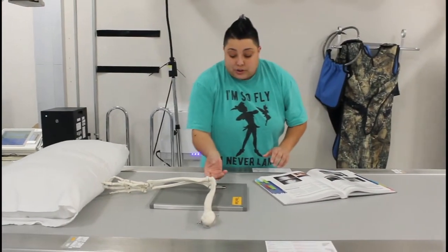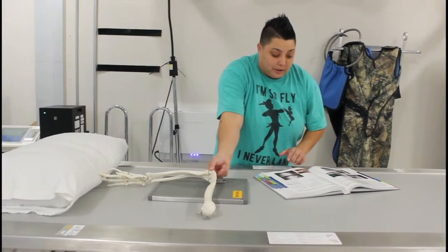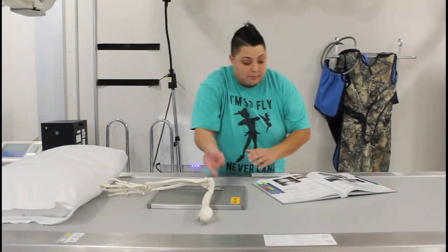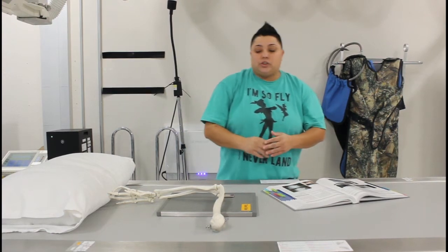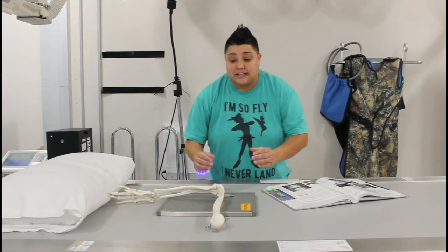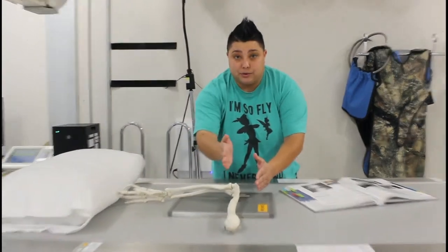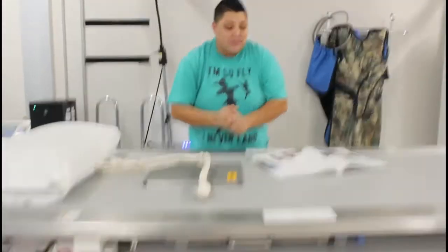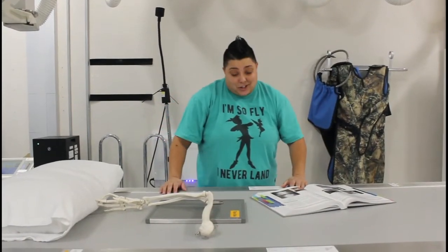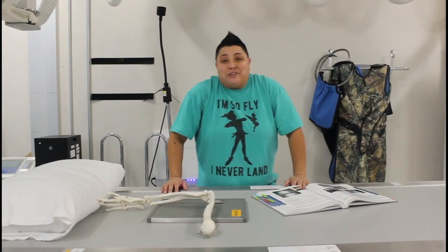You also want to make sure that you see the humeral epicondyles. They're going to be a little distorted because of the CR angulation. You also want to ensure that the elbow is flexed at a 90-degree angle. And the final thing you want to be sure of is that you have that bony trabecular detail and surrounding soft tissue.